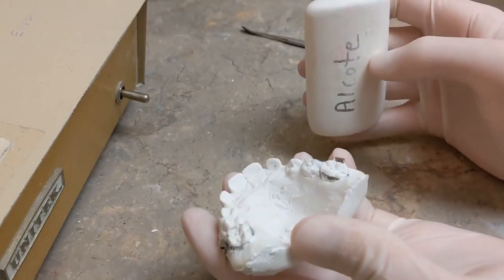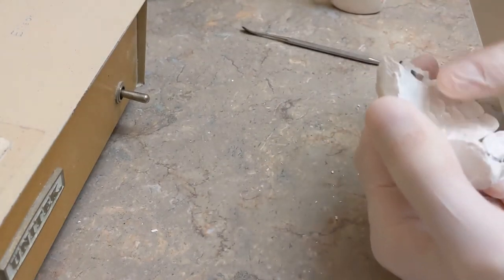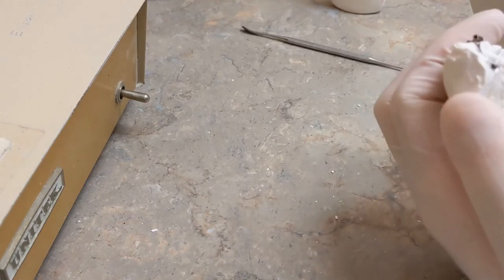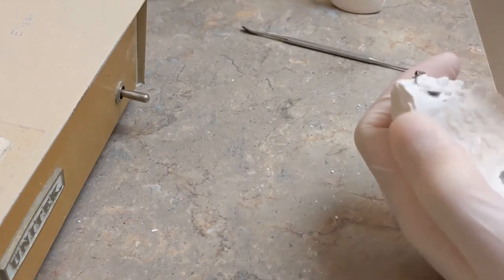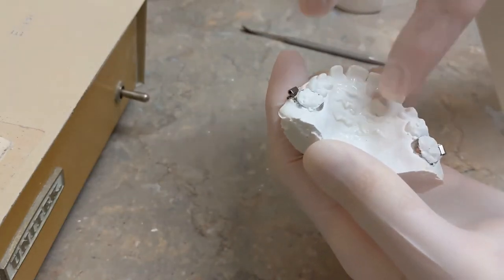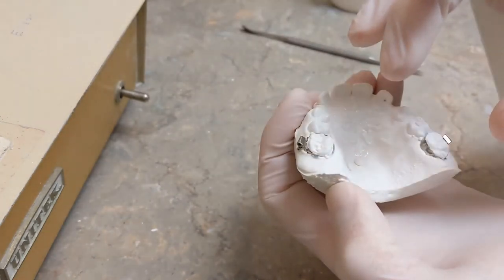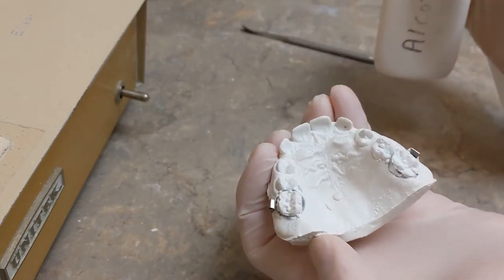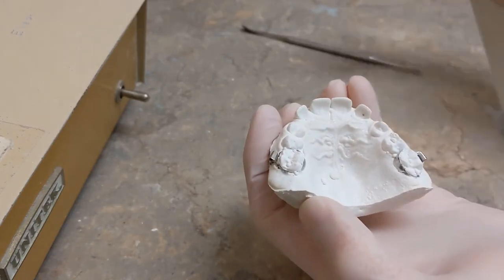Immediately after you do that — this is extremely important — right away put all-coat on there. Just put a bit on and spread it around with your finger. You want to put all-coat wherever you're going to make the little acrylic button of the Nance appliance, because this provides a barrier between the acrylic and the stone. If you do not put the all-coat on well enough or you forget, the acrylic will stick to the stone and taking the Nance appliance off is very difficult — it ends up pulling stone away with it. So put all-coat on first so you know it's done and you won't forget.